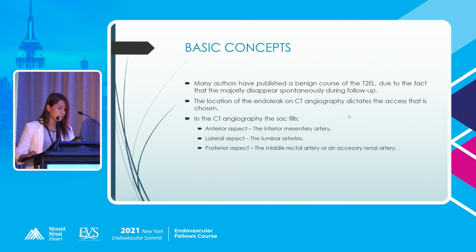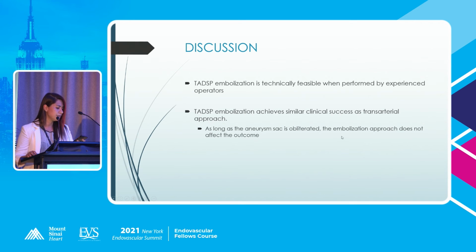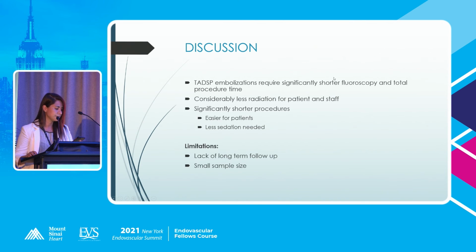artery. Finally, this access is technically feasible when performed by an experienced operator, and also shows similar clinical success to the transarterial approach, with the limited literature that we have. The other point is that it requires significantly shorter fluoroscopy and total procedure time, less radiation for patient and staff, and less sedation is needed. The real limitations are the lack of long-term follow-up and the small sample size.